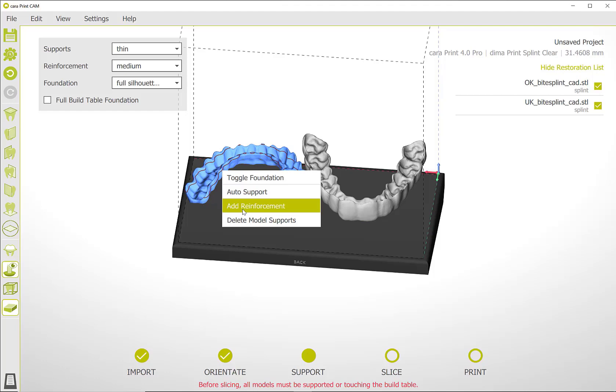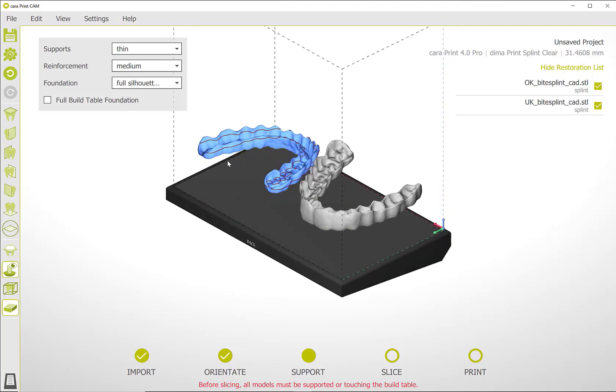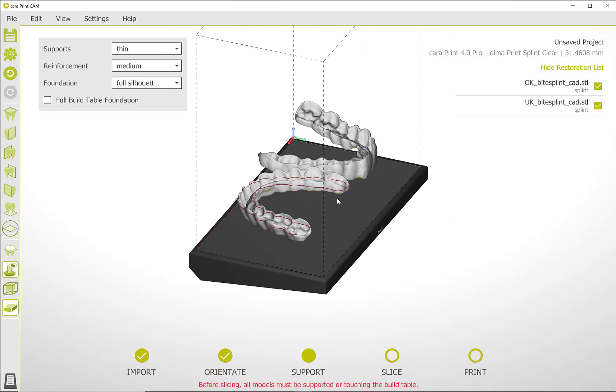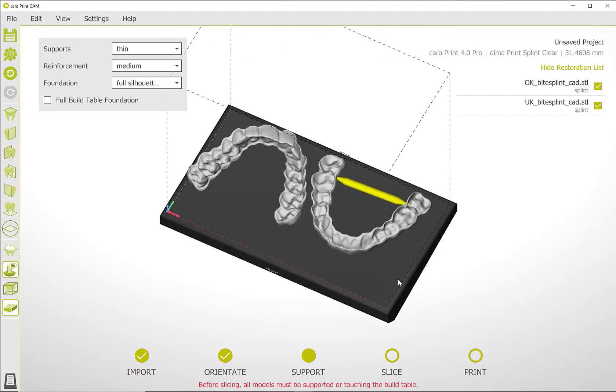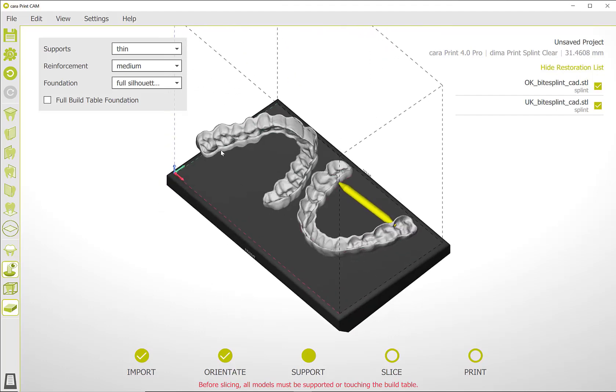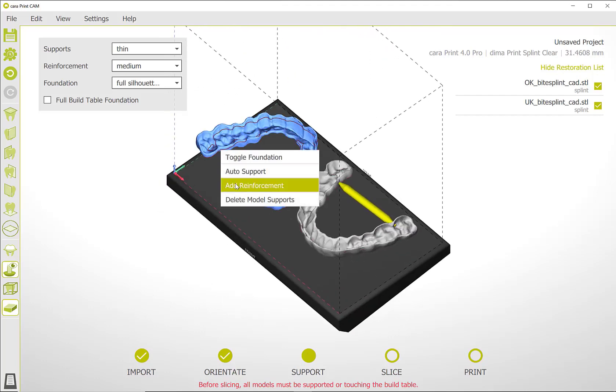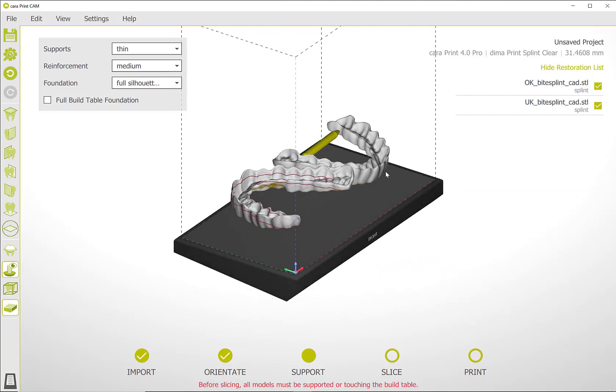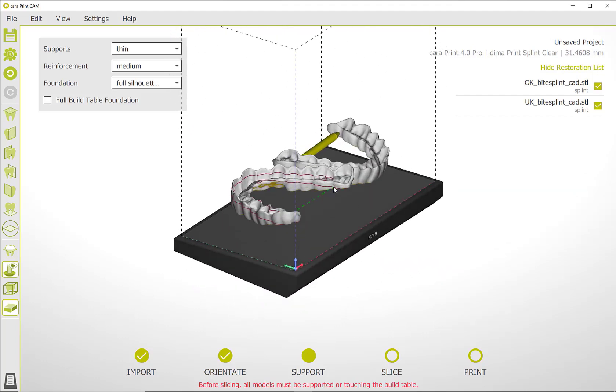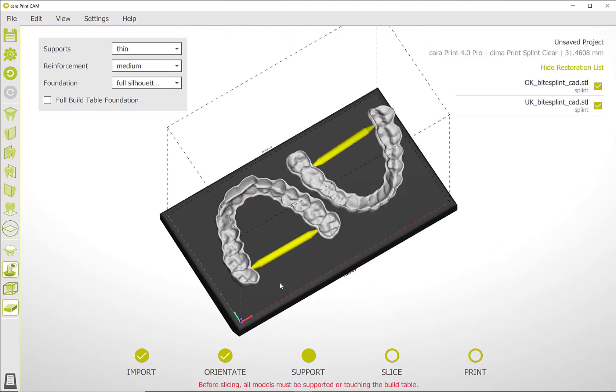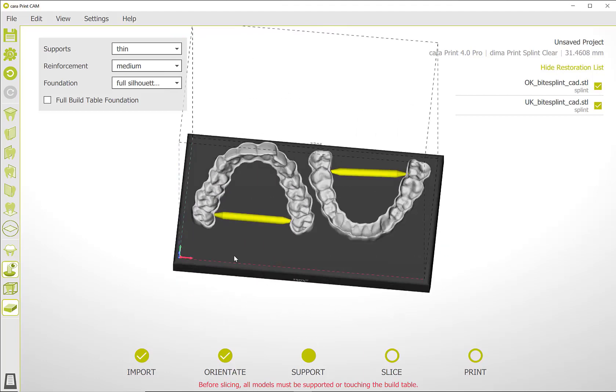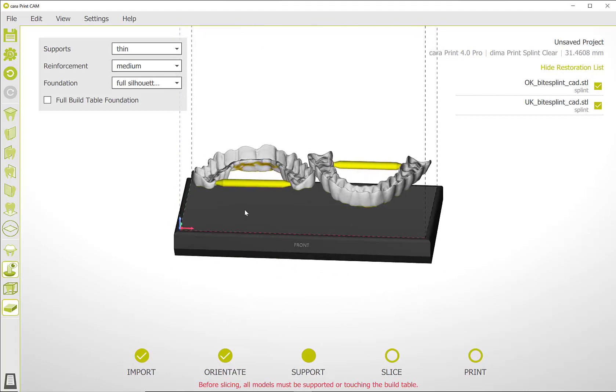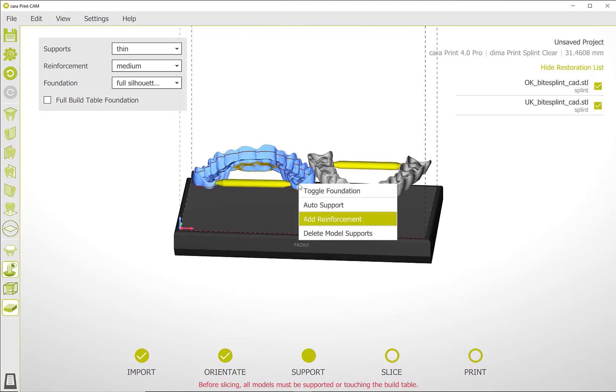Then use the left mouse button to select the two points where the reinforcement bar is to be placed. Proceed in the same way with any further reinforcements. Click the right mouse button again to activate the submenu and then generate the auto supports.